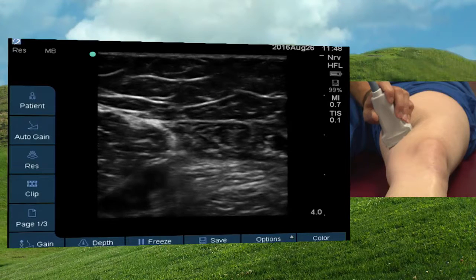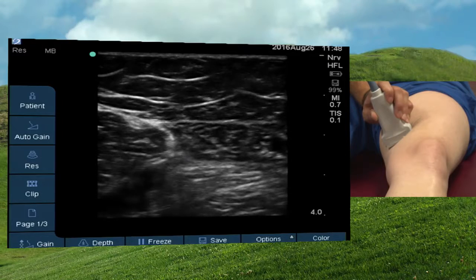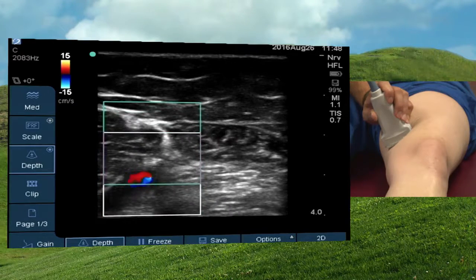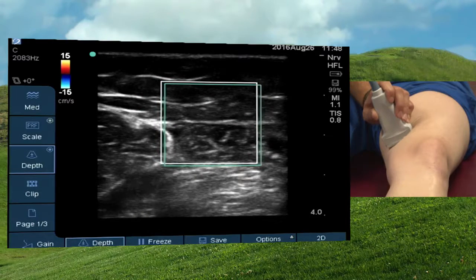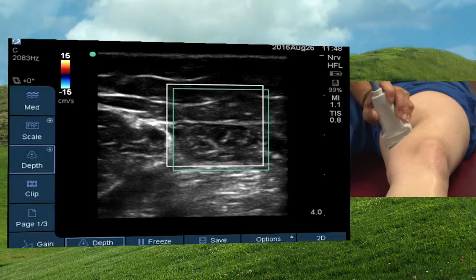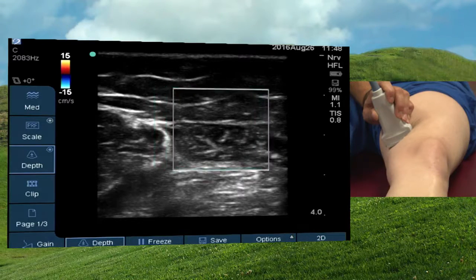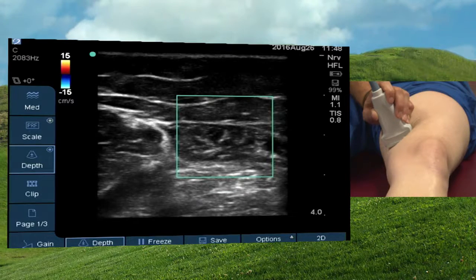And so this is what's called an adductor canal block. And the nerve, I'll use the bottom left corner of the box here. It's going to reside in here somewhere. It might be this little lit up structure. The point is, what we do is we flood this area with local anesthetic.